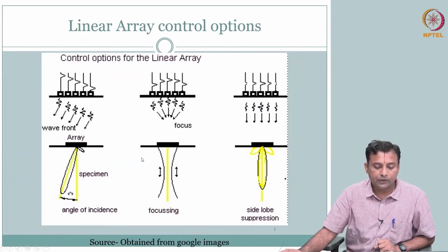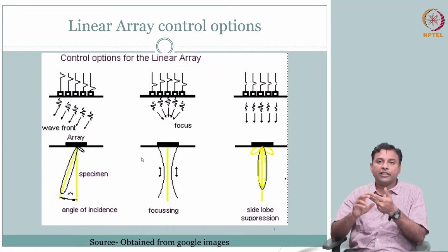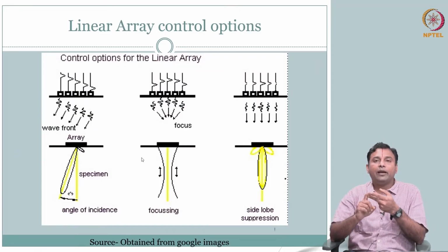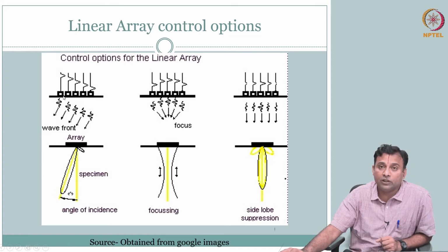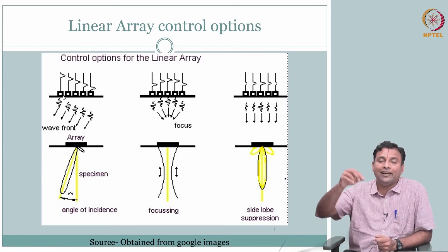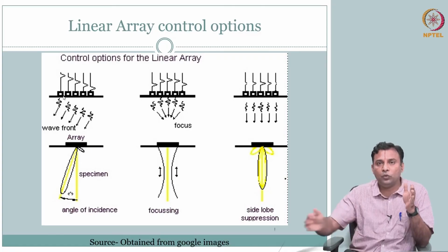Okay. So, why are we able to do different functionalities? The reason is here. Essentially what happens is, it becomes complex because now instead of having only one lead, we had a transducer, we had one wire coming out. So, you supply electrical voltage, electrical pulse, it will vibrate, sound goes out.